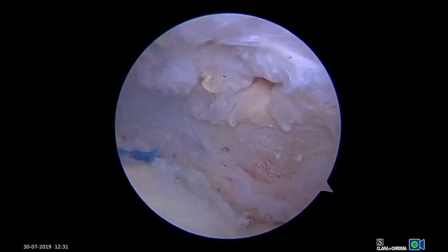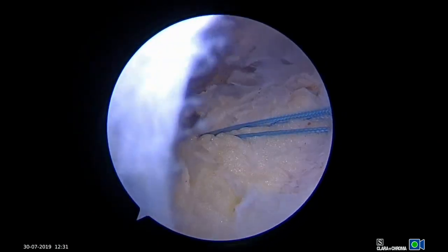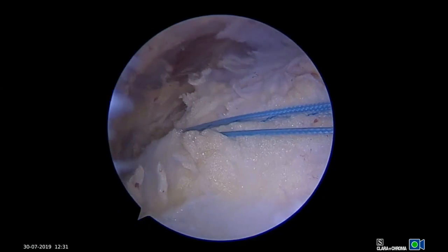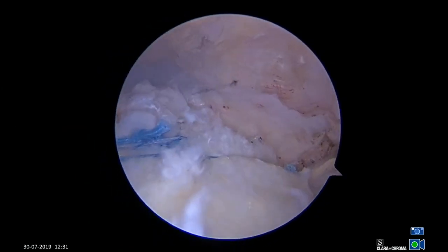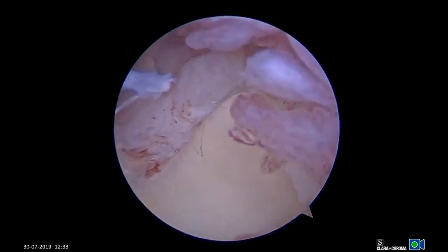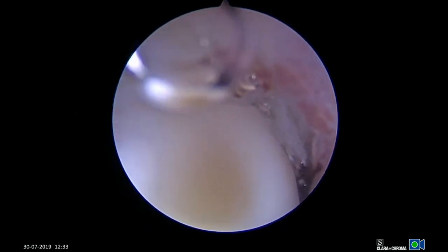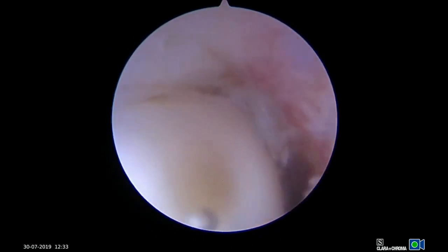The final repair construct is visualized from the subacromial space. Finally, the repair is visualized from the glenohumeral joint and shows excellent apposition of the articular margin. In summary, this technique provides all the advantages of converting a pasta tear to a full-thickness tear without the disadvantage of taking down intact Sharpey's fibers.